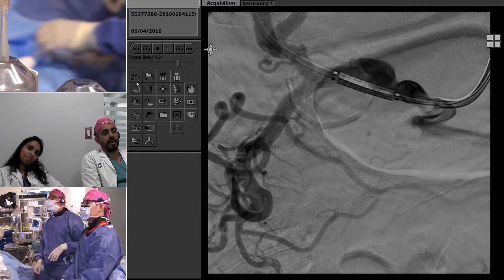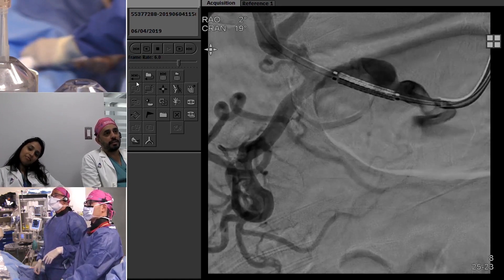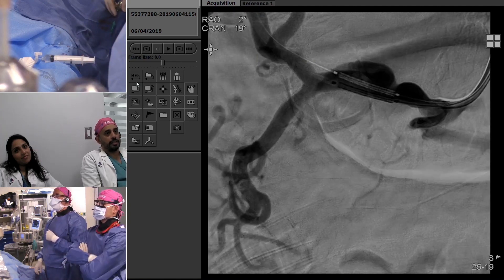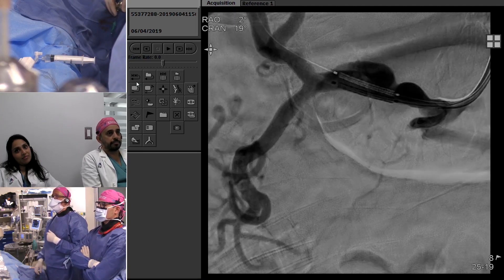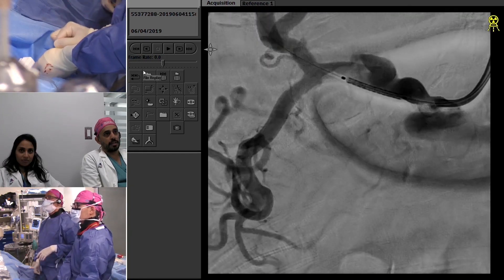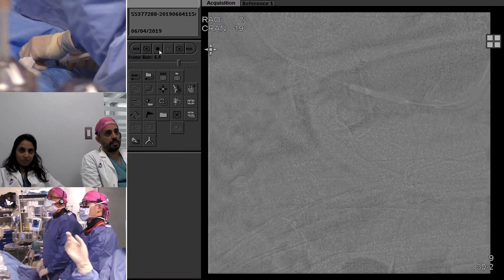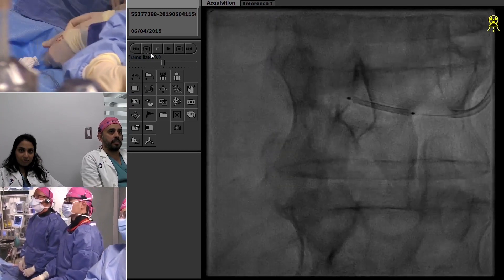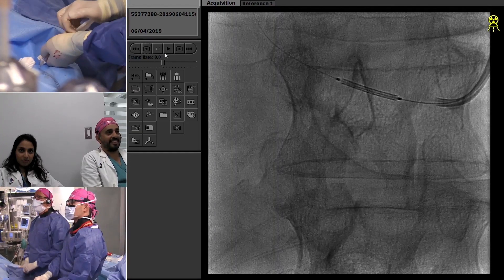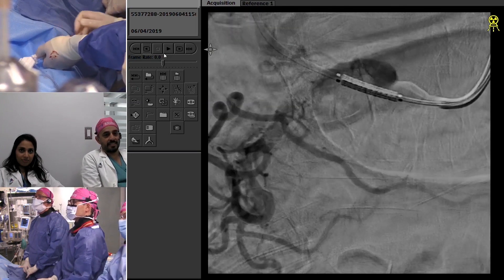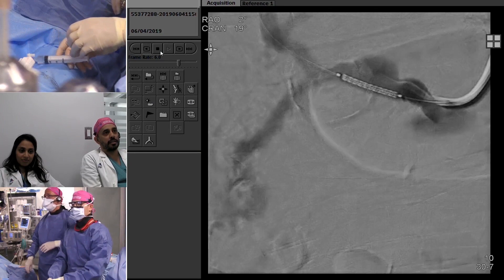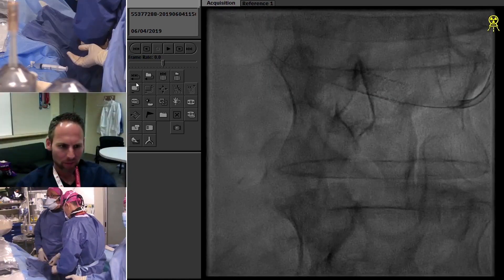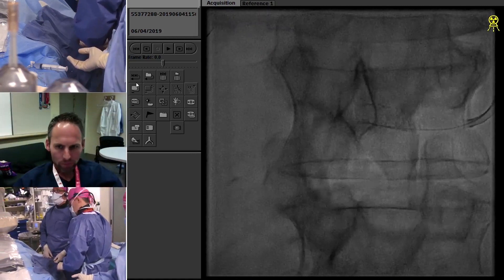There's discussion about stent positioning — a vote to advance slightly forward, landing just proximal to the narrowing without going too far. We take the stent up to about six and a half millimeters. We like MR surveillance for all visceral aneurysms, especially when placing platinum coils, so it's important not to use stainless steel products if planning MR surveillance. An important technical point: I don't want to give up the support wire because it stabilizes the guide as we introduce the microcatheter.